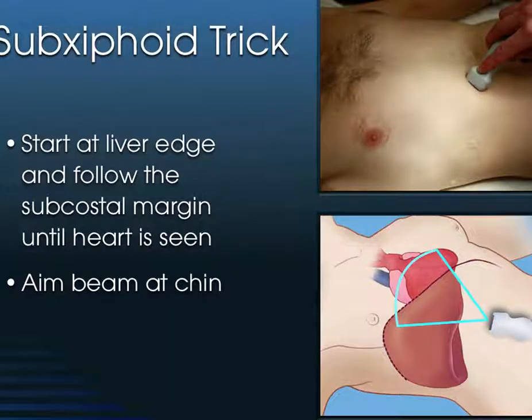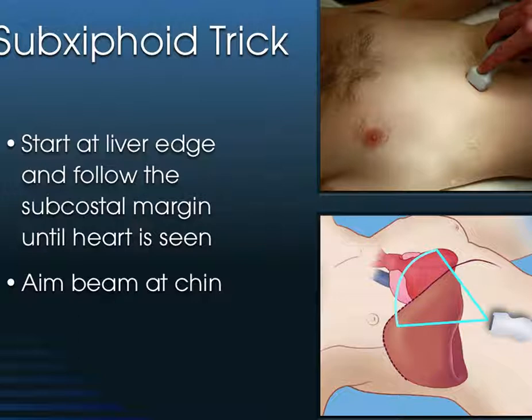Whenever you look at the heart, I think it's helpful to look at it in multiple windows. The first window we think about is a sub-xiphoid view. What you're going to do is actually aim the beam towards the chin of the patient. You always think about the heart sort of being on the left side of the screen, but what we're really trying to do is aim the beam towards the patient's chin. In doing so, we still use that liver as our margin.